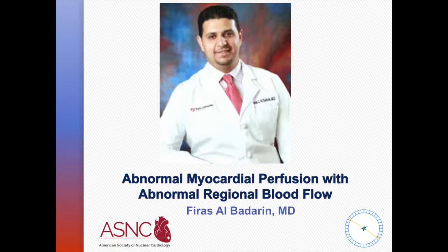I think the availability of myocardial blood flow information has changed the paradigm of the way we interpret myocardial perfusion imaging. It used to be a binary decision, normal or abnormal, and with anything that is abnormal or potentially abnormal, proceeding to the invasive catheterization laboratory.